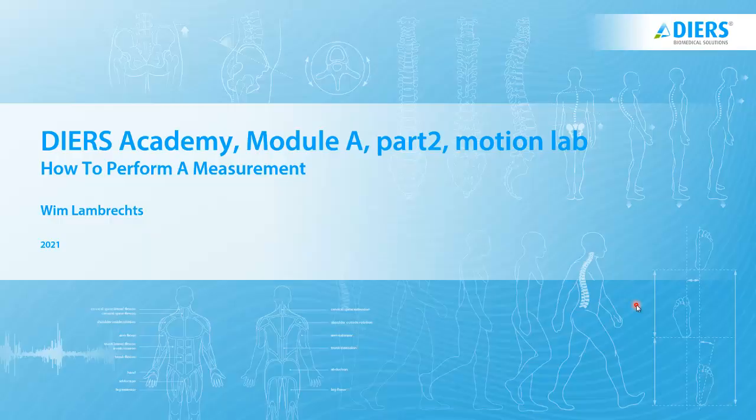Before we move forward, I would like to state that it is important that you either have a look at the first part first or that you are already mastering the use of our posture lab, because within this presentation, we do use some concepts that are based on the concepts that are discussed and that you use within our DIERS posture lab.